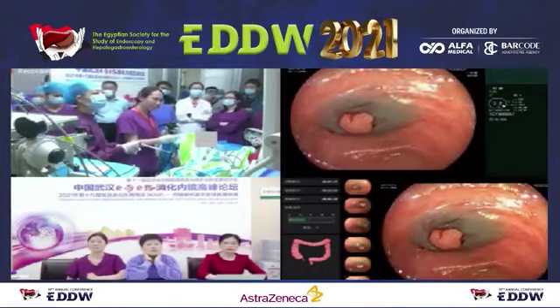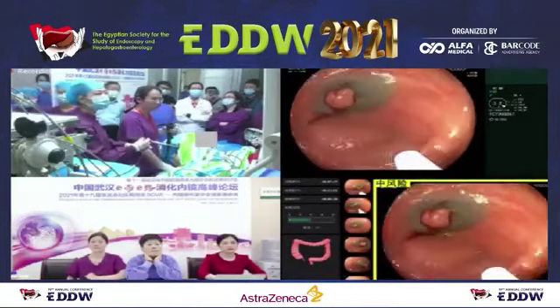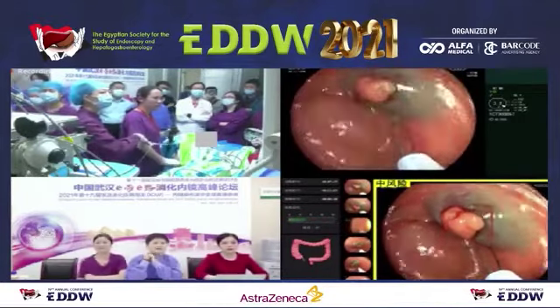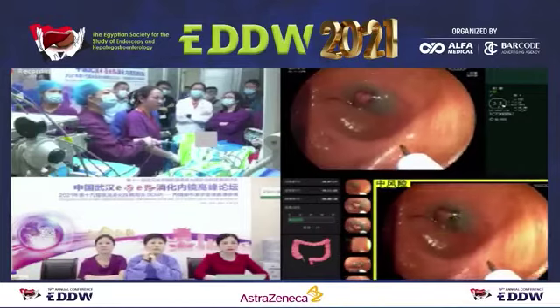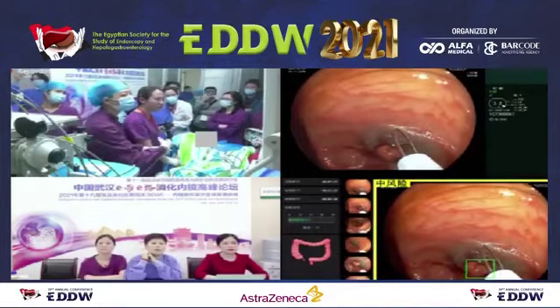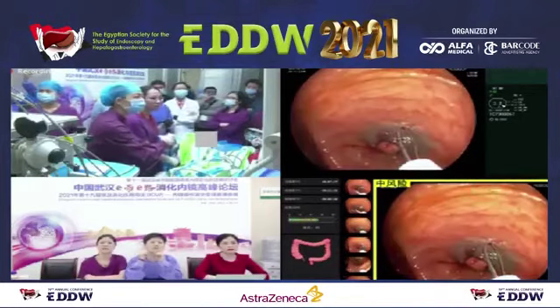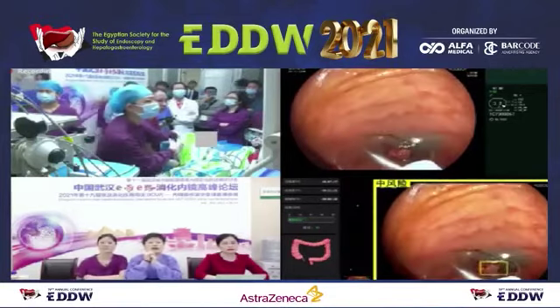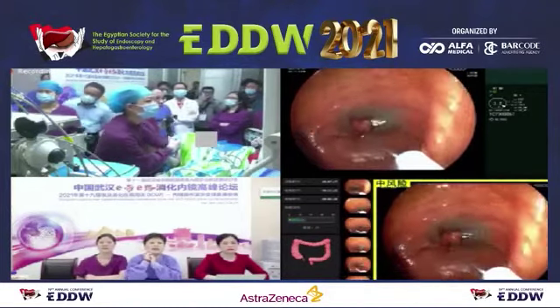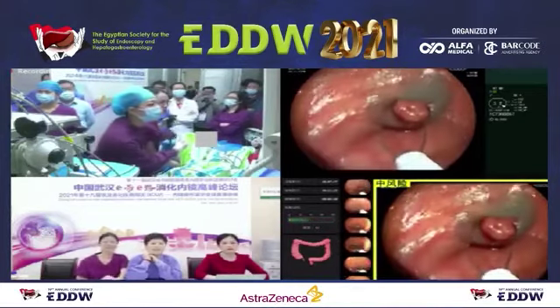Professor Liu Jing, I have a question. When will you use the cold snare to remove the polyp? Do you mean what did I use for the submucosal injection? No. When will you use the method of cold snare to remove the polyp? We have two ways to remove polyps: hot snare and cold snare.